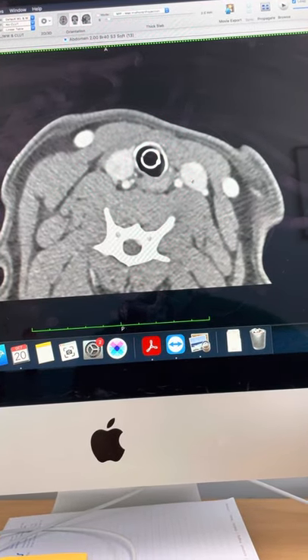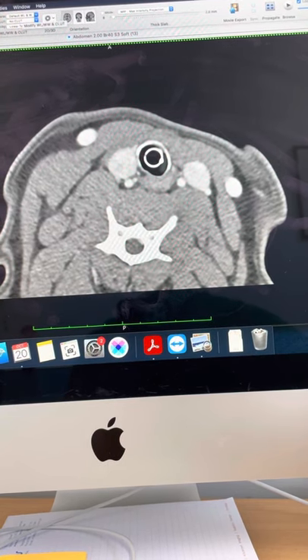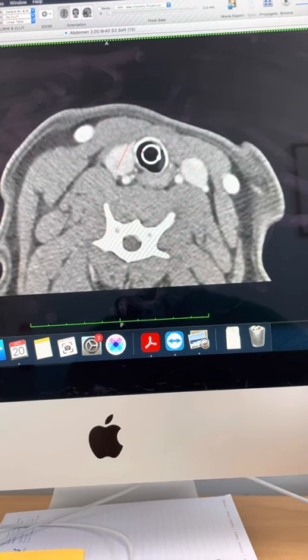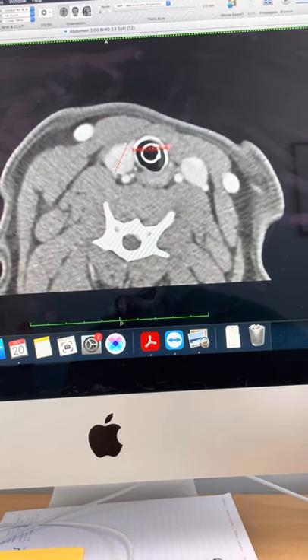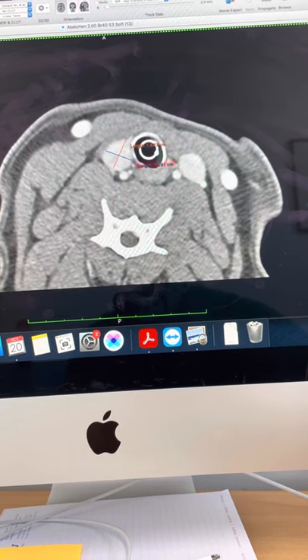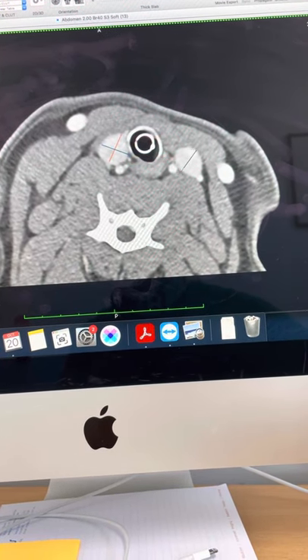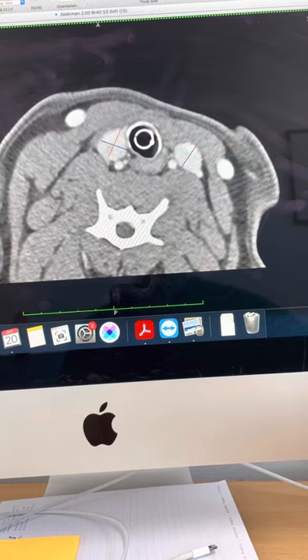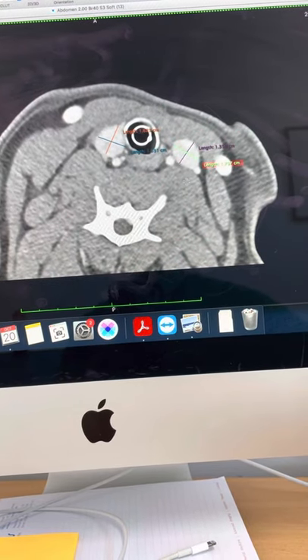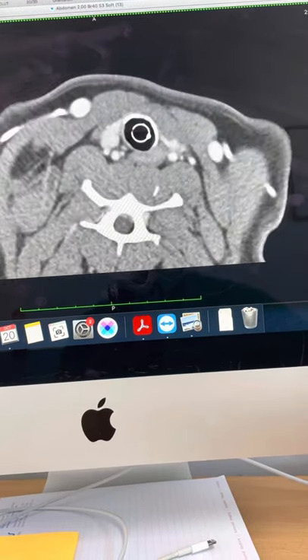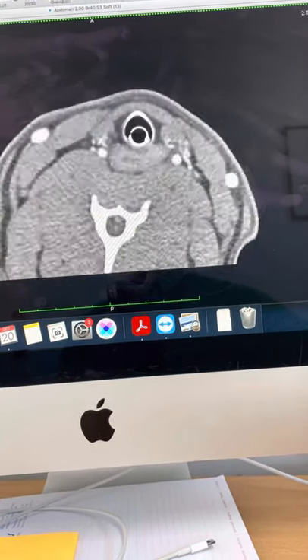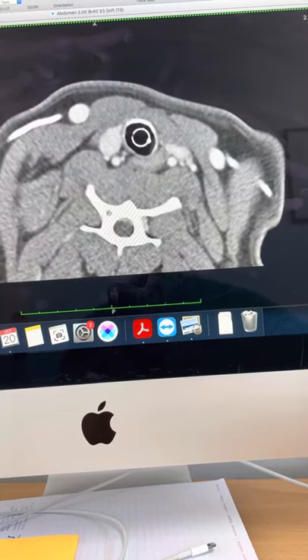There's one here, and there's another one just here. If I put the calipers on these, they're about 16 millimeters by 15 millimeters and about 13 millimeters by 17 millimeters. So it's interesting because both of the thyroid glands are enlarged.